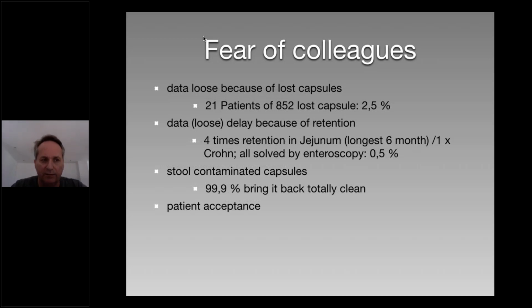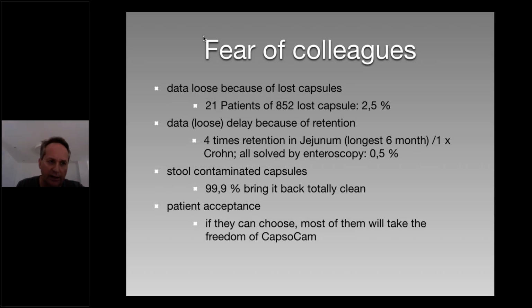When we started, I was not convinced what the patient would say, because they have to bring back the capsule, they have to search for it in the stool. But it's really, really good. When we started, I let them choose data recorder or bring back the capsule, and most of them told me, please give me the system. I have no data recorder and I will be free over the day.